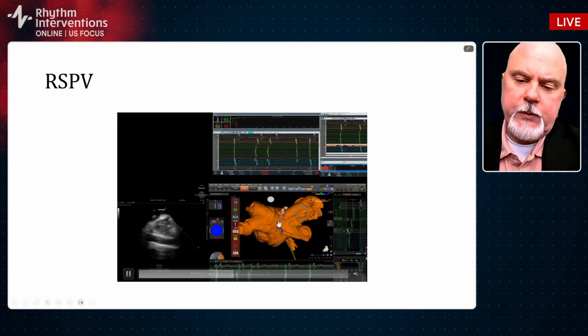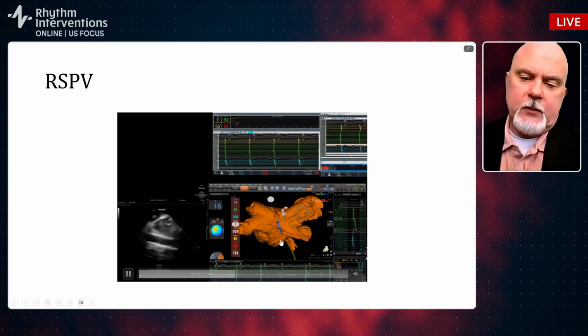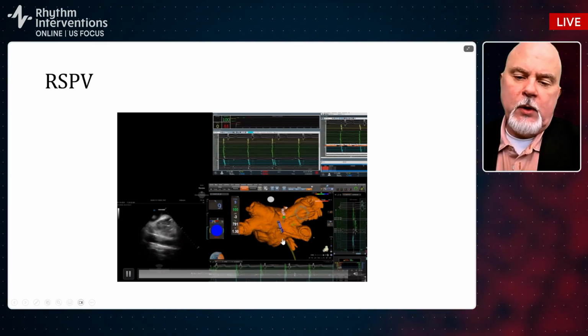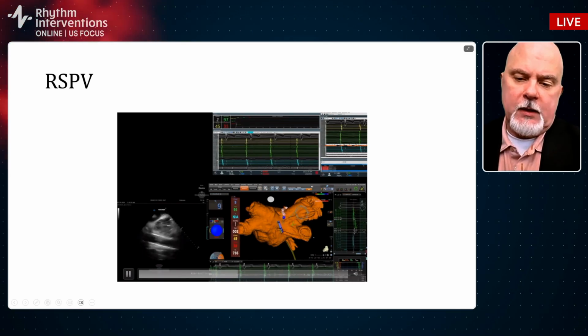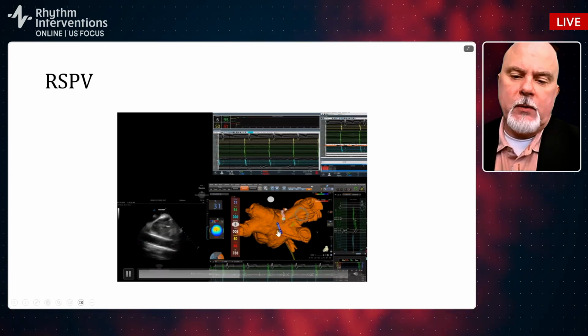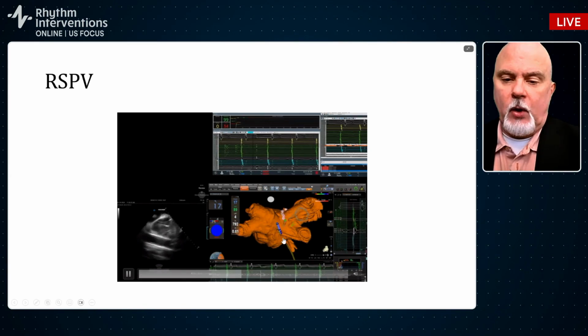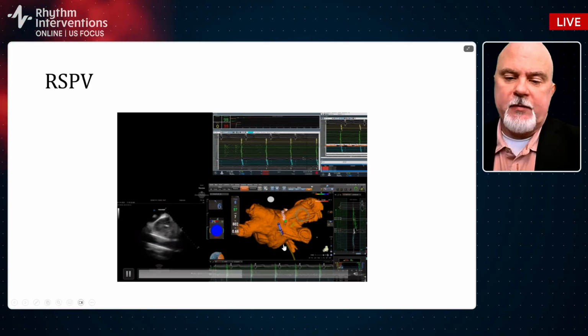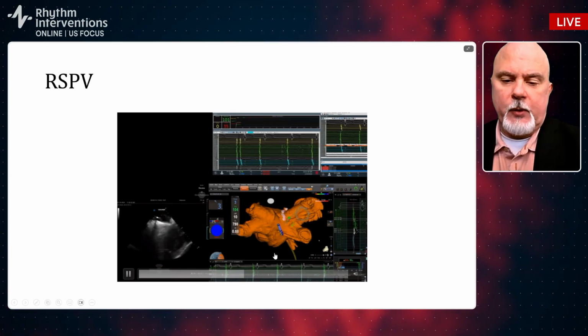This blue catheter that you're seeing right there is actually co-located with the temperature probe within the esophagus. So we've got a sensored catheter aligned next to a temperature probe. While I don't think you actually have to always measure temperatures from the esophagus, this is our standard, and I'm just showing you the approach that we use.